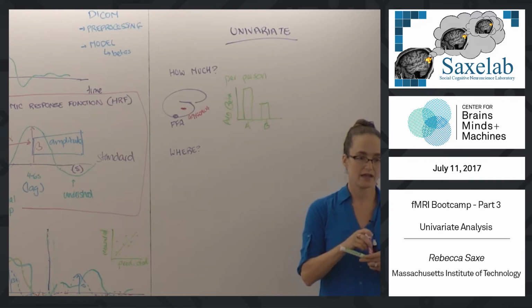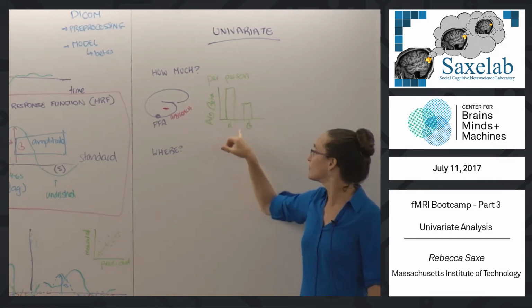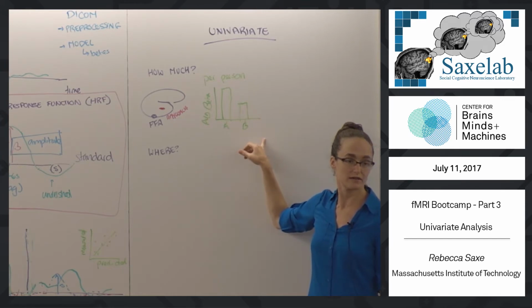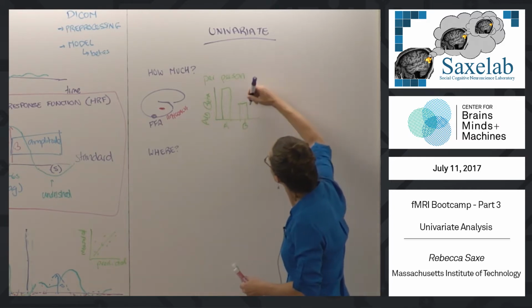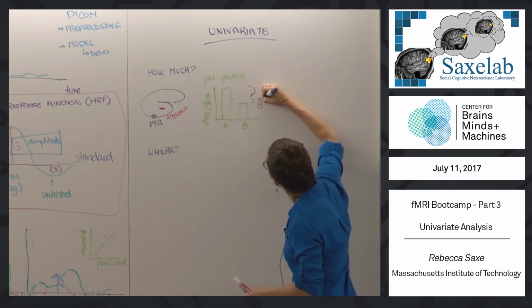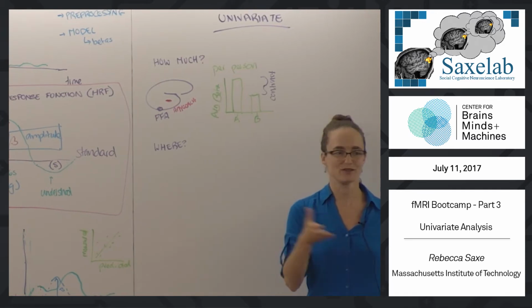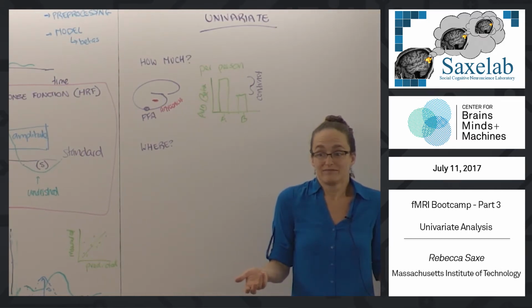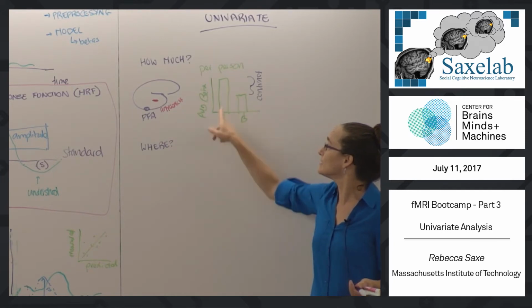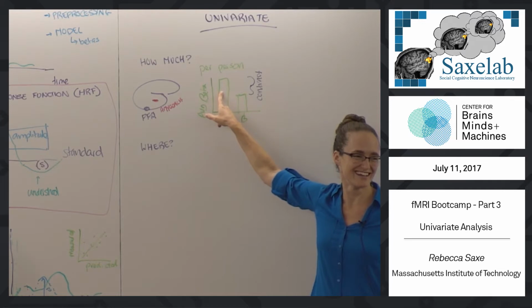Okay? So I found the amygdala based on anatomy, or the FFA based on prior knowledge, or whatever. I found the brain region I care about. Then I take all those voxels that are in there, and I take their average beta value for condition A and the average beta value for condition B, and that gives me a difference. Right? Okay. That difference of the betas is also called the contrast value, or the con. But that's just the name of it. That's the name of the value of the difference. So now I know a number. Right? The amygdala for conditions A and B, the contrast value is 0.5, which is just as unhelpful as beta values were, right? Because that's beta value minus another beta value in arbitrary units, right?